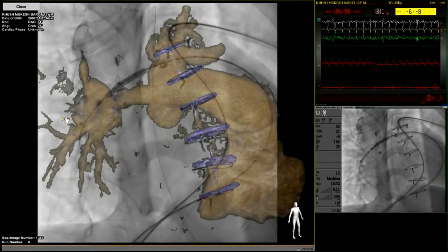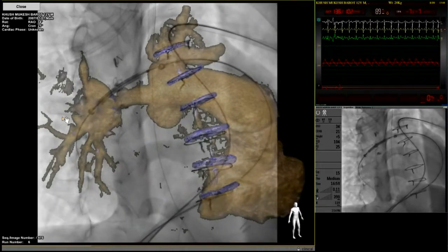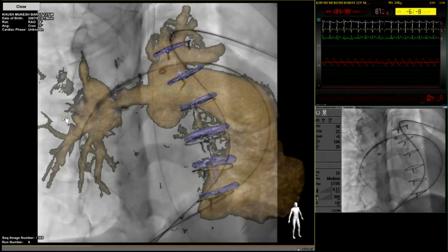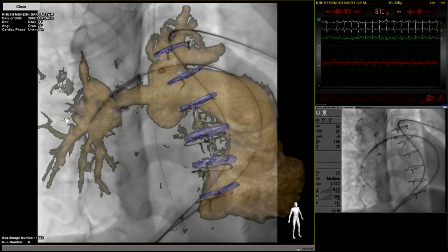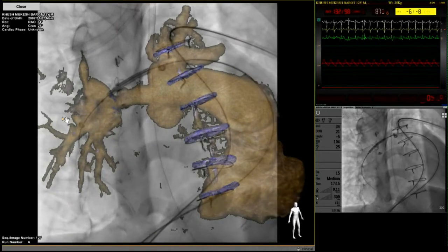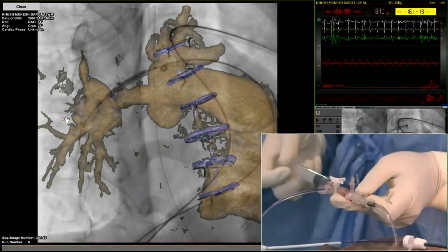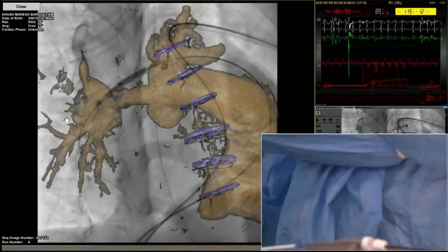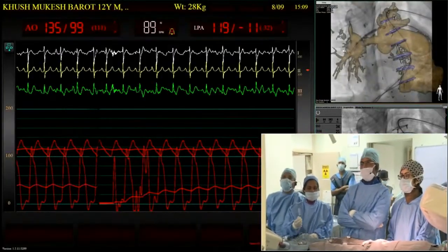So now I'm going to peel back. Sister, don't inflate, I'll tell you. I am just peeling back my sheath. So now I'm going to make a sidearm injection. Can you give me some contrast? I can show you the proximal RPA pressure now. Open the pressure line. This is the RPA pressure just before the stent, which is 120 now. So not much of difference has happened, Chetan.